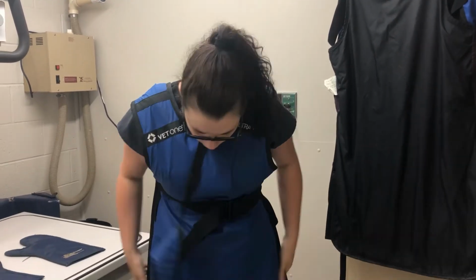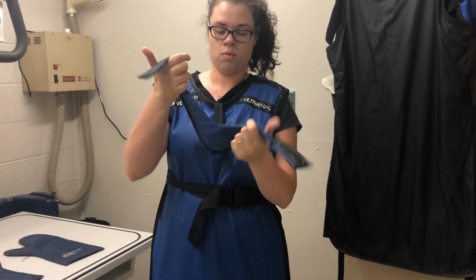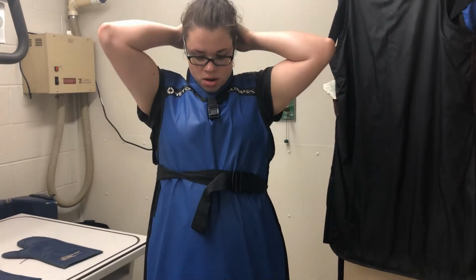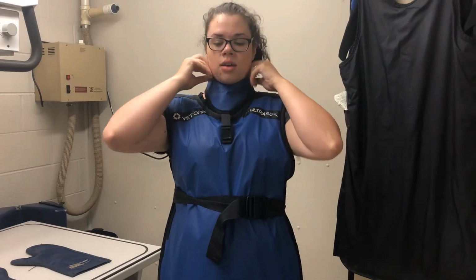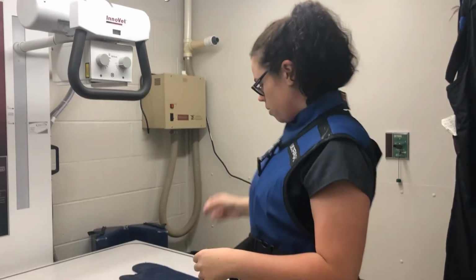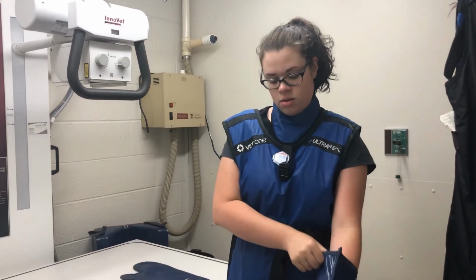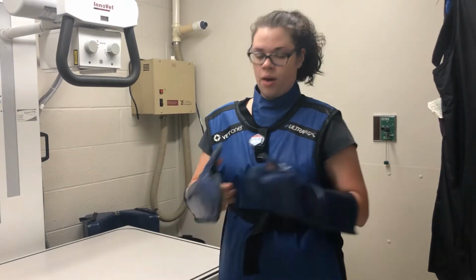Make sure that it's all covering, and then our thyroid shields, which have magnetic snaps on them, we'll put around here. Snap that on and adjust. Okay. And then we grab our dosimetry badges that monitor our radiation, and we put that on our thyroid shield clip. Put our gloves on, and we're all set.